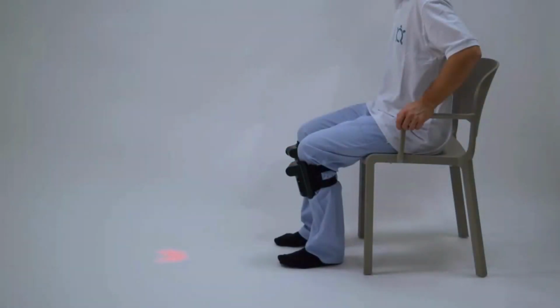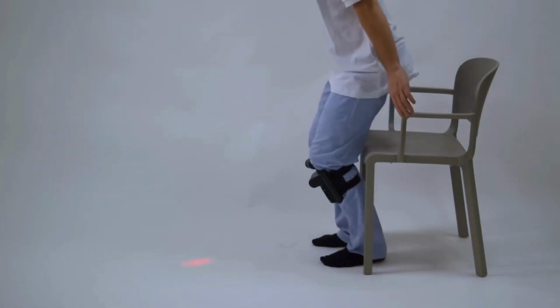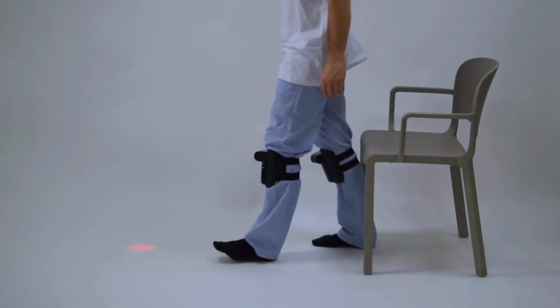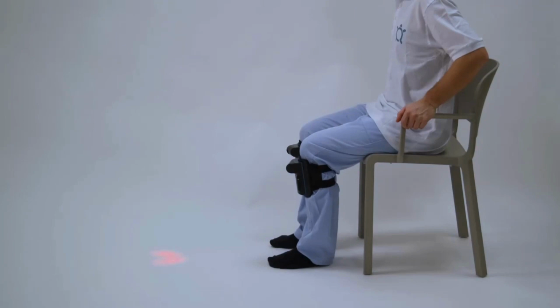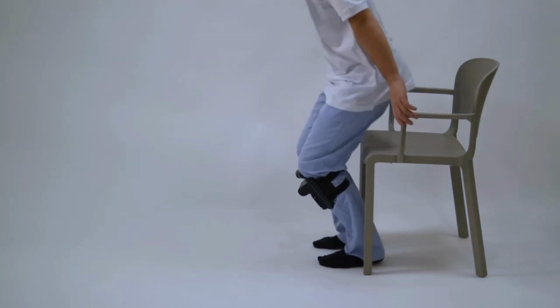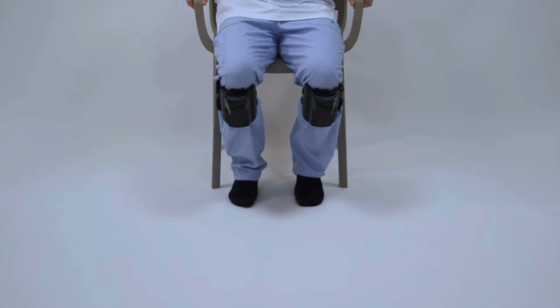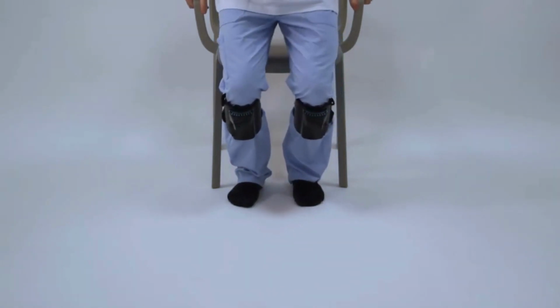Sit to stand. You can use cue walk as a tool to facilitate motor tasks, such as getting up from your chair. Feedback is very useful in patients with cognitive deficits, attentional deficits, or with neurological or neurodegenerative lesions. In this exercise, we take advantage of the feedback switch-off related to knee flexion.